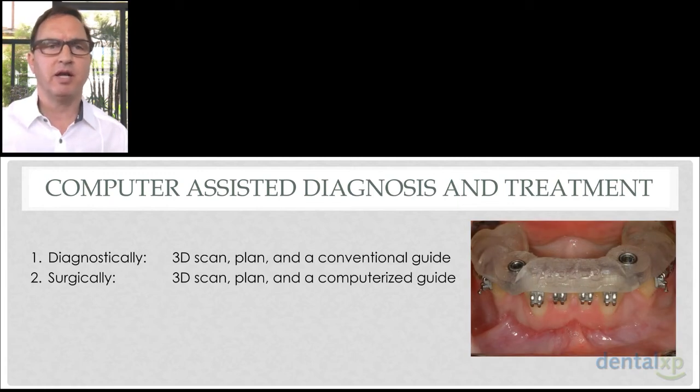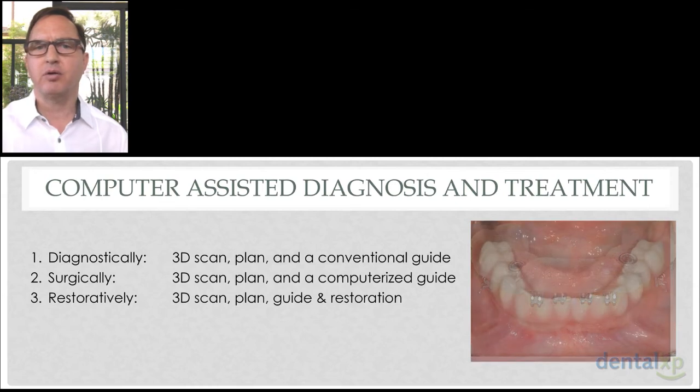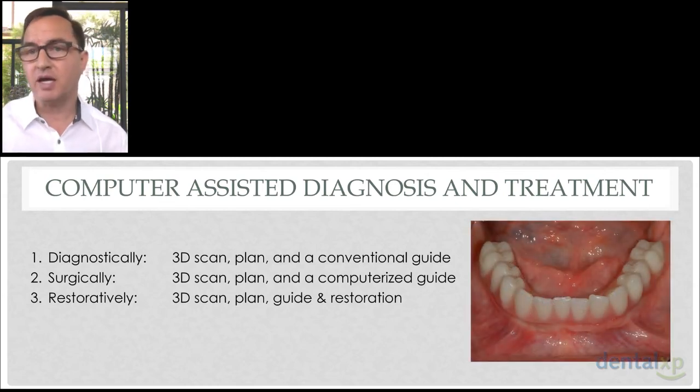Additionally, you can utilize it restoratively, and that means getting the scan, generating the plan, ordering the guide, and with the guide, performing some procedures in the laboratory, maybe with the inclusion of a computer-generated immediate smile cast or an immediate smile bridge, immediate smile restoration. This implies the possibility for immediate loading.